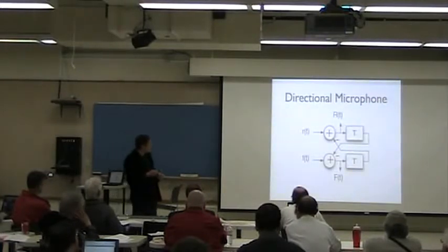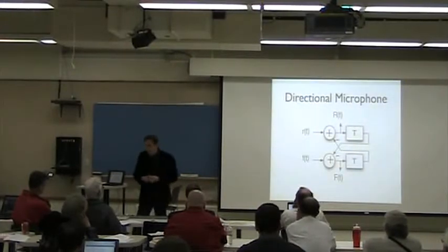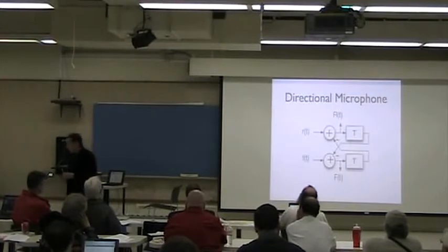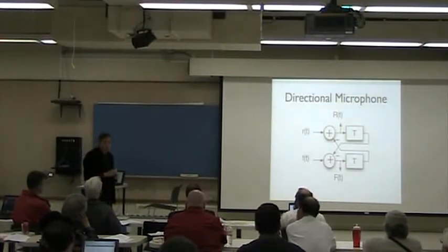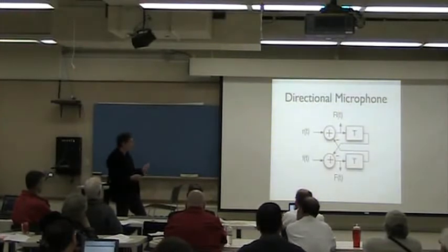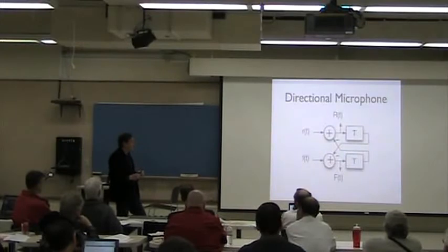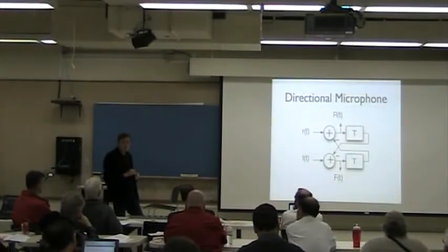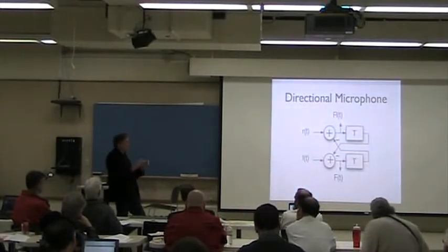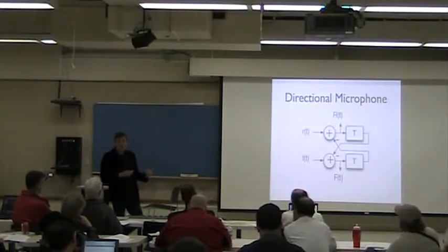So basically, we have these two components which are sub-sample delays. It's not like z minus 1 in the previous picture, because we're talking about a 20 microseconds delay. In our case, with a 32 kilosamples per second sample rate, we're talking about a delay shorter than the distance between sequential samples.